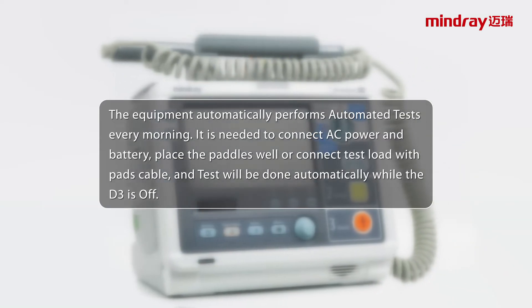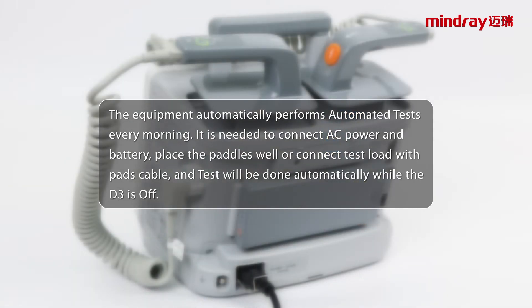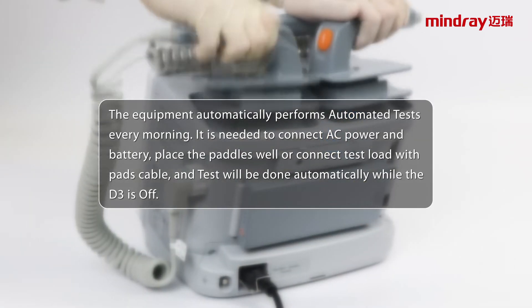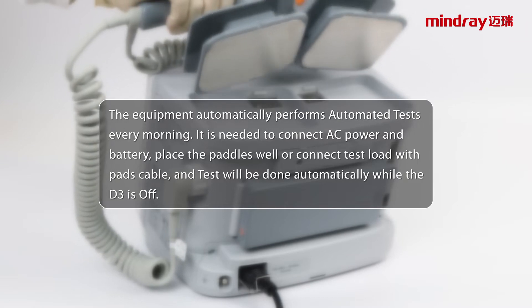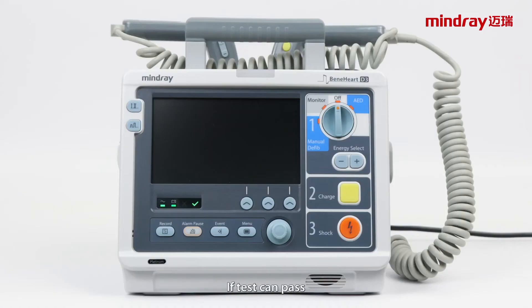The equipment automatically performs automated tests every morning. It is needed to connect AC power and battery, place the pad as well, or connect test load with pads cable, and the test will be done automatically while the D3 is off. If the test can pass, the green status indicator is illuminated.